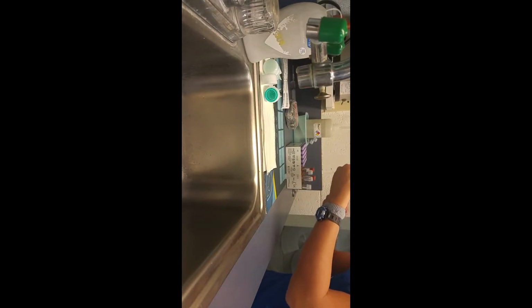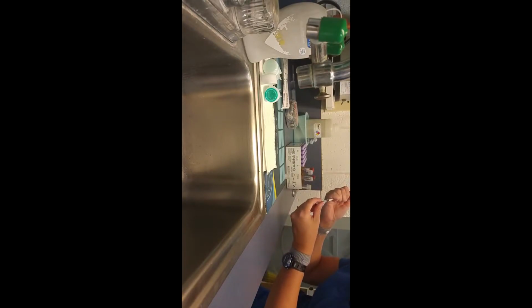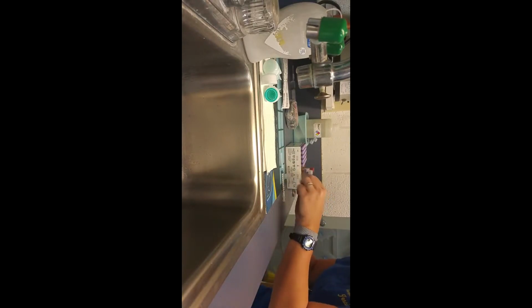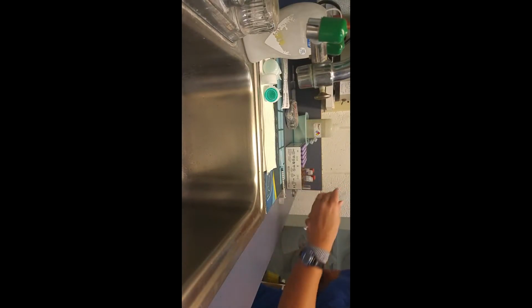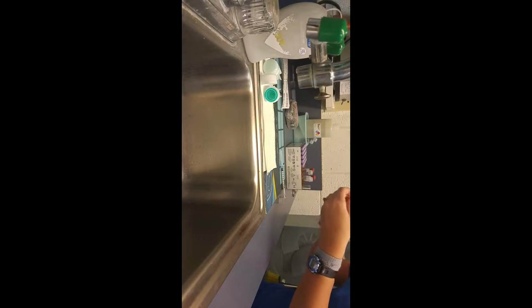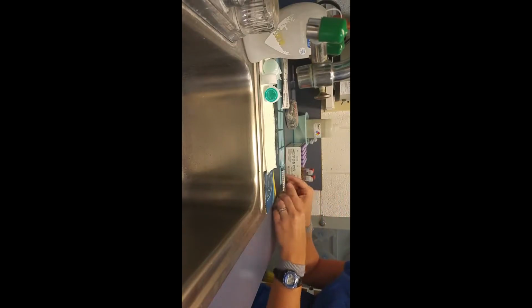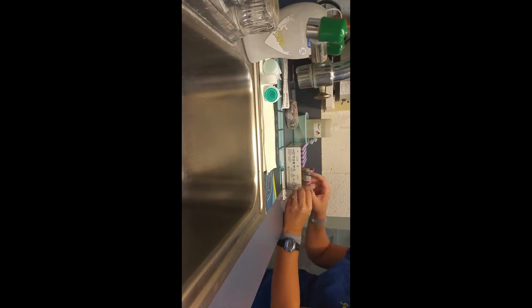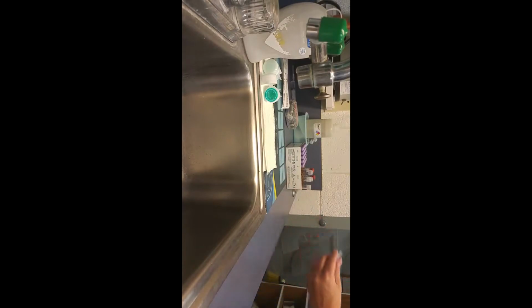The 0.98 mLs of saline. I've already measured that out, so I'm going to go ahead and put that in there. The cap on there. Go ahead and do that to this one here. Two new samples here. I've washed red blood cells with the saline. We're going to move on to our next step.